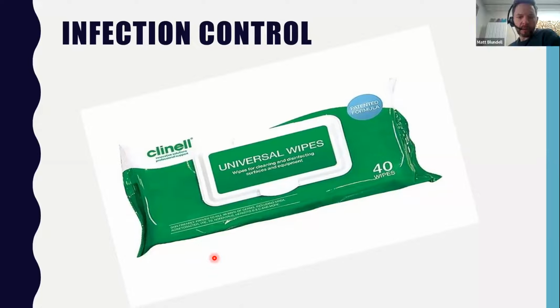Just a bit about infection control. Make sure, obviously, if we're doing chest drains with the guided or assisted route, you're using a probe cover.